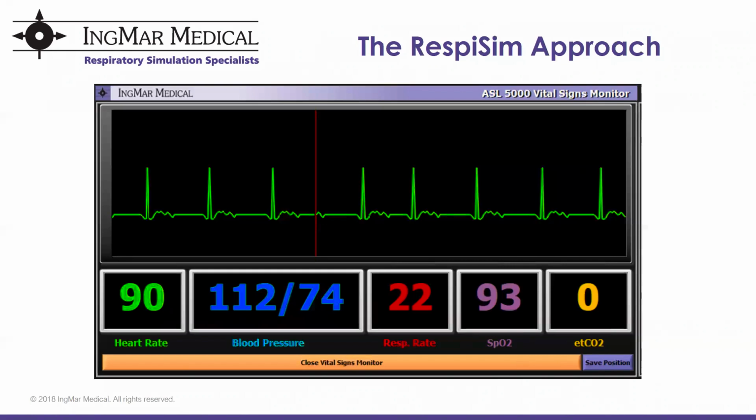Our computer that's used to control the system can be connected wirelessly. It can also be connected by Ethernet through an ad hoc network that we create using a router. The second screen for displaying the student information is just a simple USB monitor.